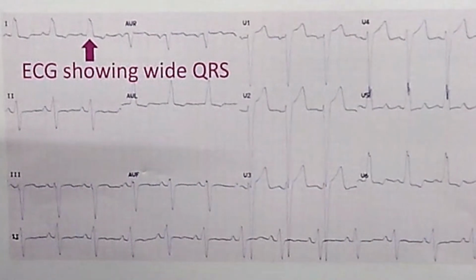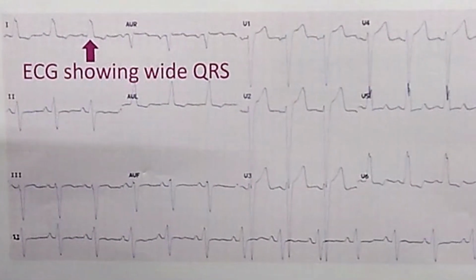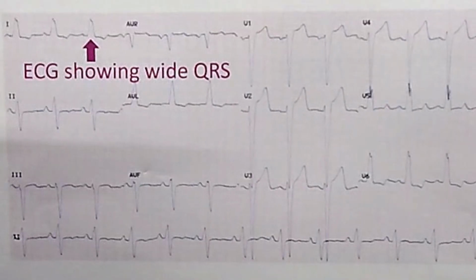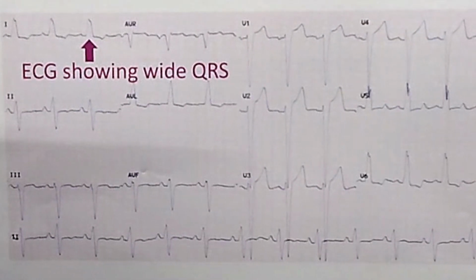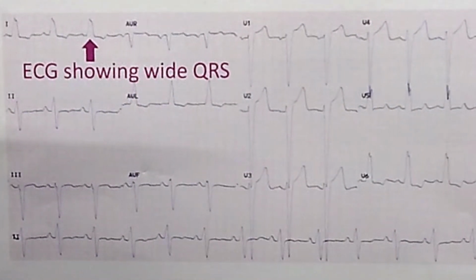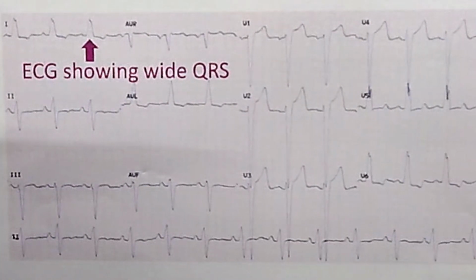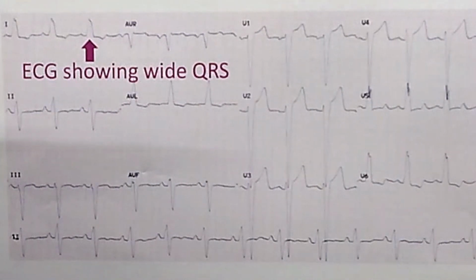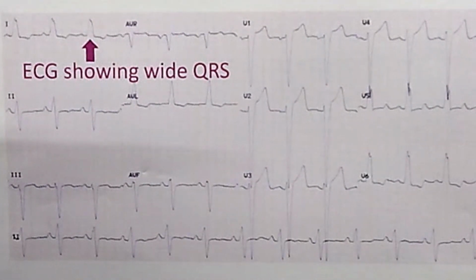In cardiac resynchronization therapy, the right atrium is paced first, and after an AV delay, the stimuli to the left ventricle are synchronized in such a way that regions of the left ventricle contract as near normal as possible. That is how synchronization is achieved. The left ventricular pacing lead is usually through the posterolateral tributary of the coronary sinus.